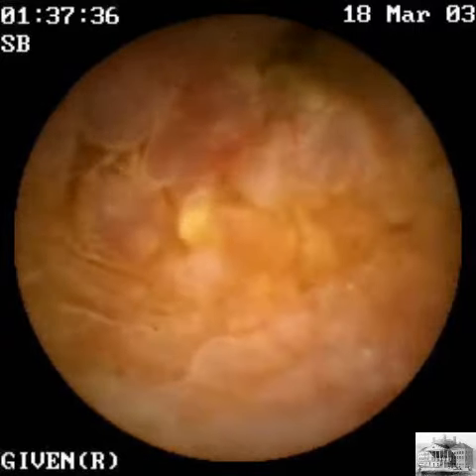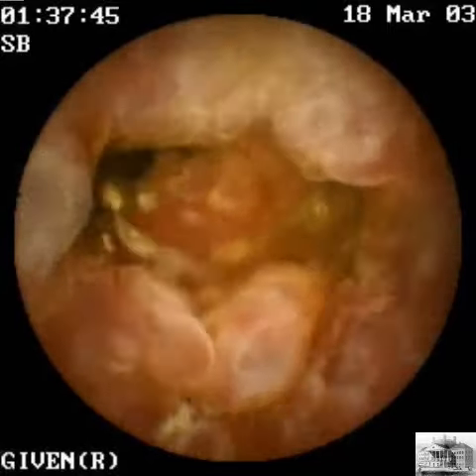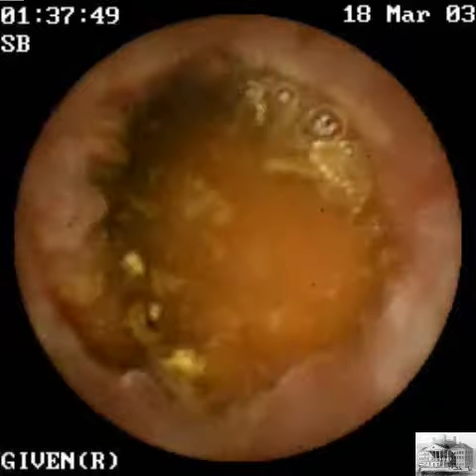The lesions seen on this video capsule study are characteristic of enteritis secondary to graft versus host disease.